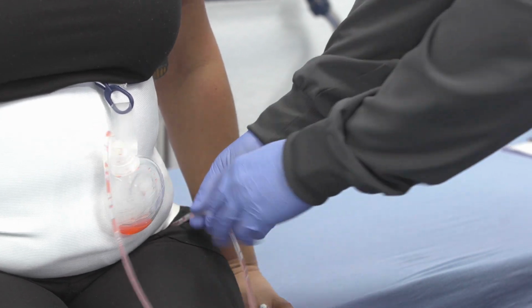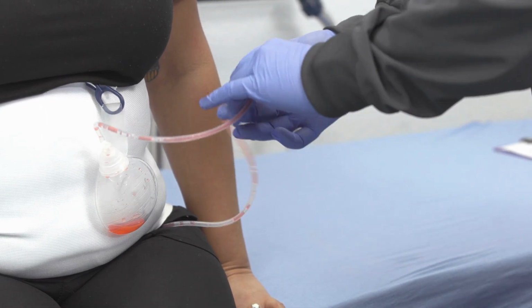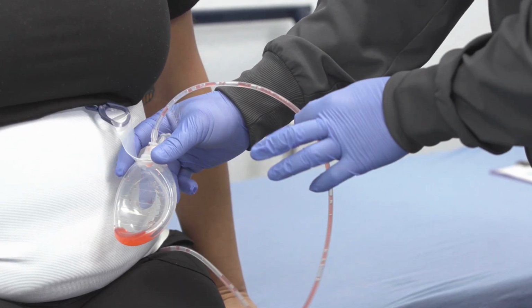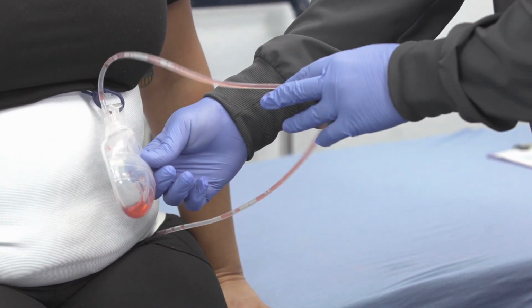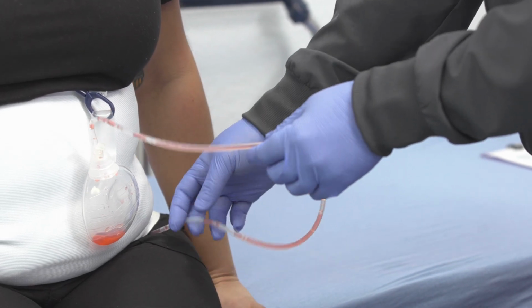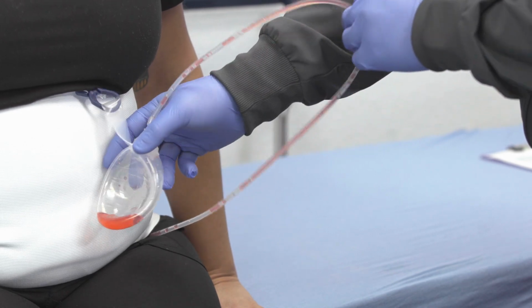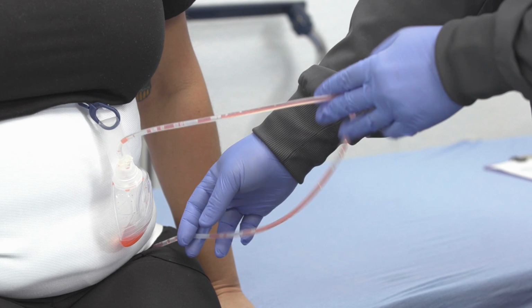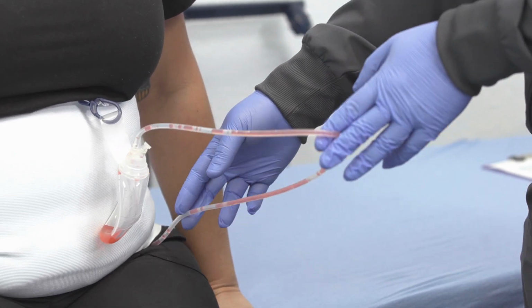If it continues to not really move and it stays where it's at, then that means that there is a potential for a block somewhere. But just keep an eye on the bulb, see if the fluid does collect in the bulb, because if it does, then you don't have a block. If there is no fluid collecting in that bulb, then you'd want to give our office or our urgent hotline a call so we can reach out to one of the surgeons and talk to them about what's going on with the drain to see if they would want you to come into the office or into the surgical center to have it assessed and potentially fixed with whatever process we have to go through.